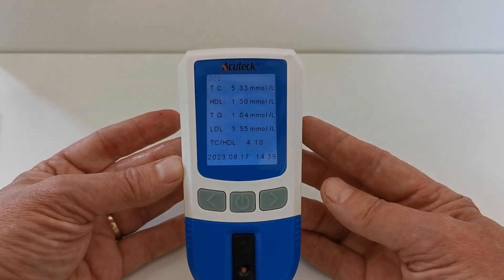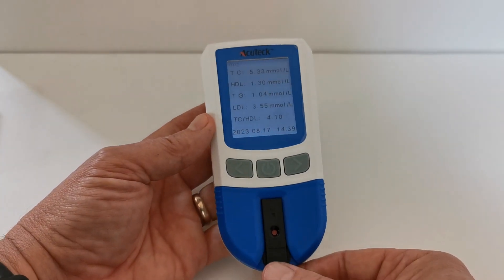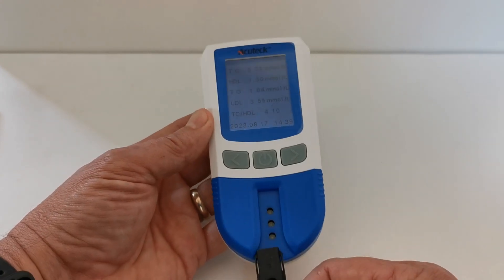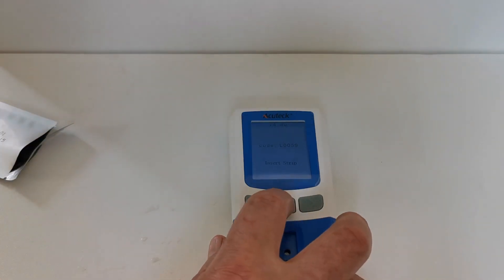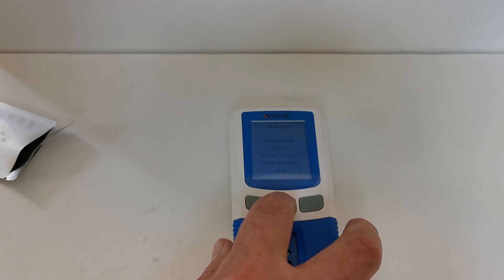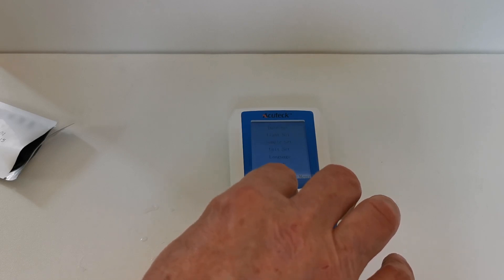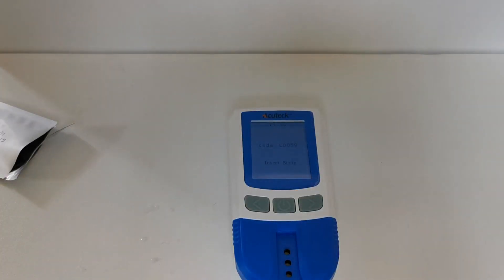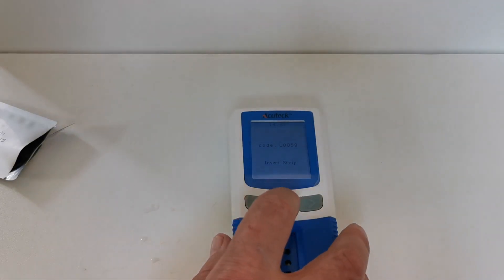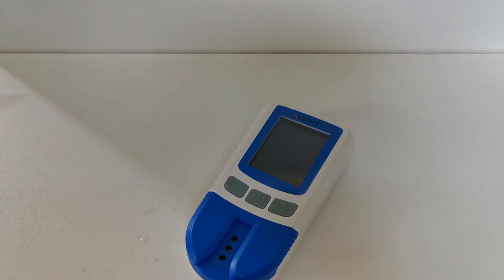That's your first test result. The meter will automatically power down after five minutes. You can now remove the test device and place it back into its foil for disposal. To power off manually, just one quick press on the power button and the meter is now in storage mode — ready for your next cholesterol test.